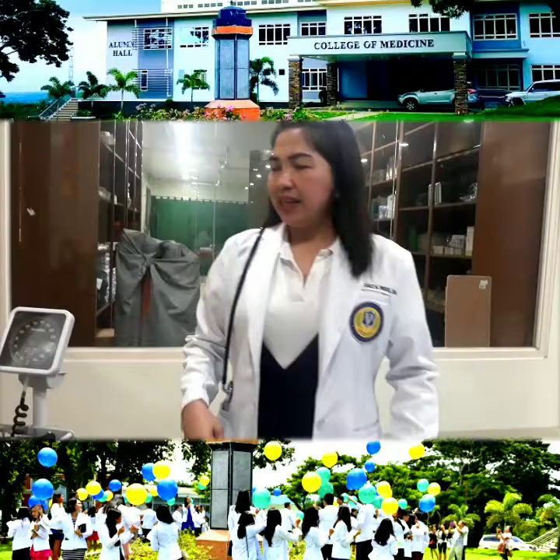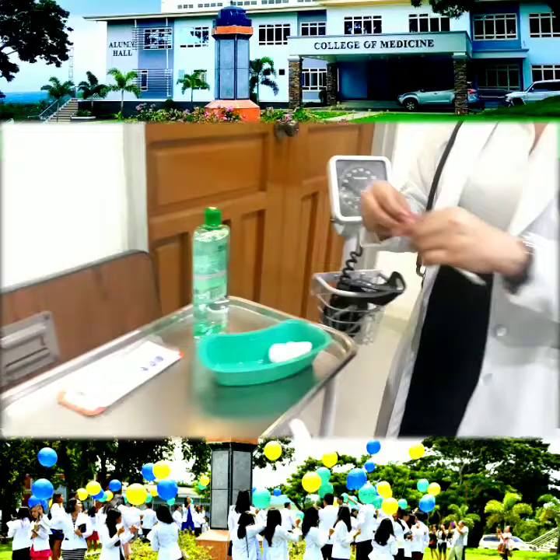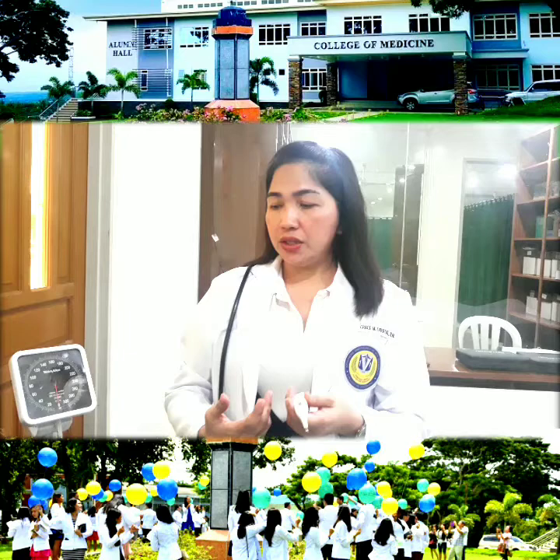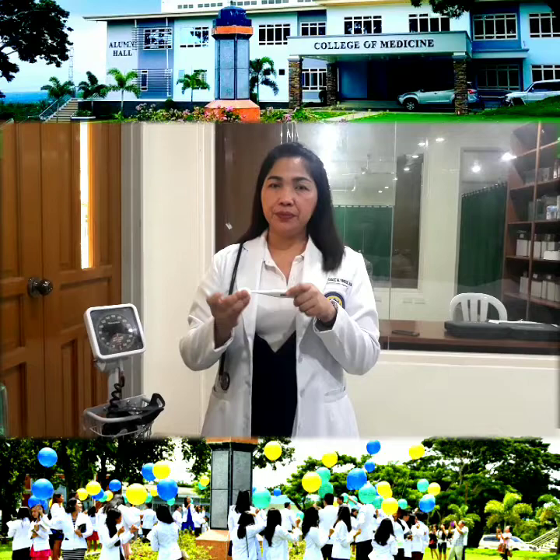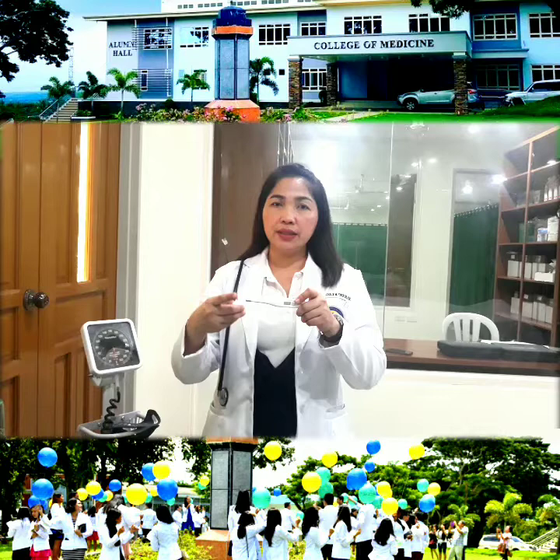So the first one — we're going to wash our hands first. Then take the thermometer. This thermometer is a digital thermometer. Even if it's digital, you still have to clean it. Using a cotton ball with alcohol, you have to start cleaning from the cleanest to the dirtiest part. Since this has not been used yet, the cleanest part is the tip of the thermometer. So you clean it with a rotating motion.